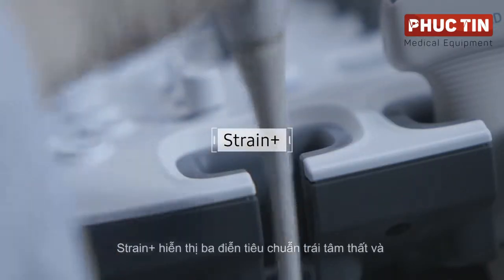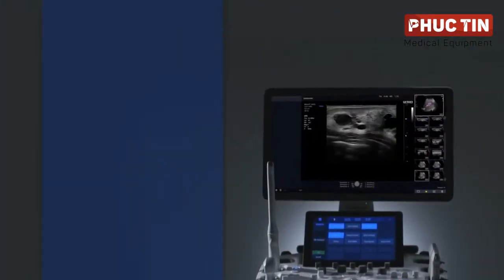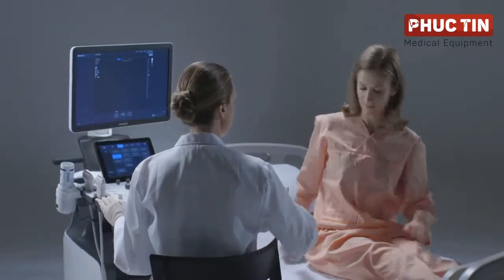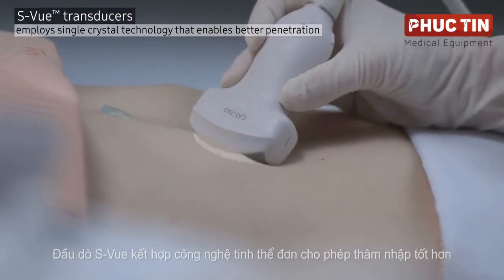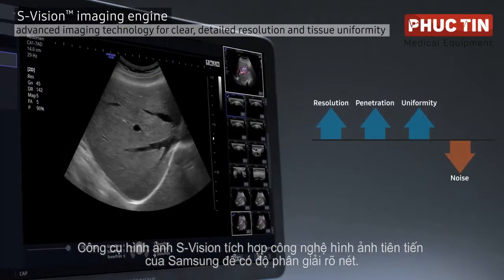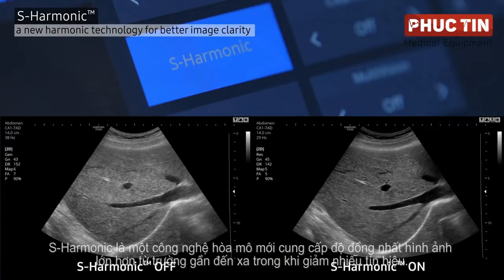N-Strain Plus displays three standard left ventricle views and a bullseye in a quad screen for easy assessment of left ventricle function. The Hs60 delivers highly detailed images to help provide accurate diagnosis by employing the S-View transducer, incorporating single crystal technology for better penetration, and the S-Vision imaging engine, an integration of Samsung's advanced imaging technologies for clear, detailed resolution. S-Harmonic, a new harmonic technology, provides greater image uniformity from near to far field while reducing signal noise.